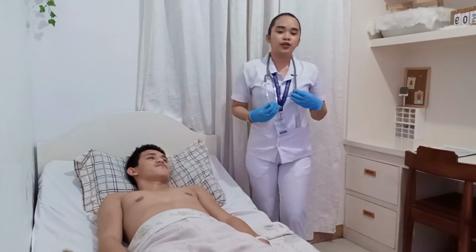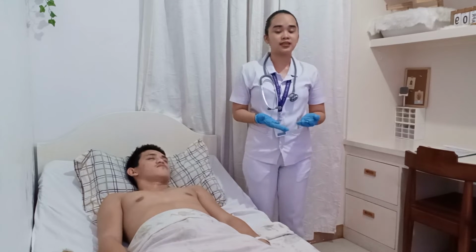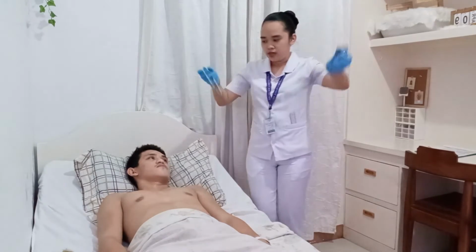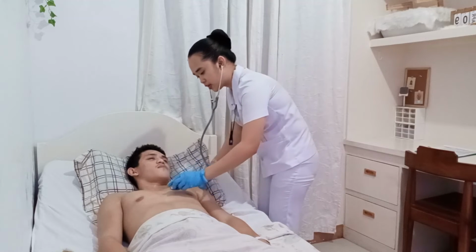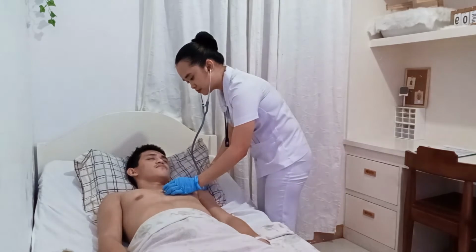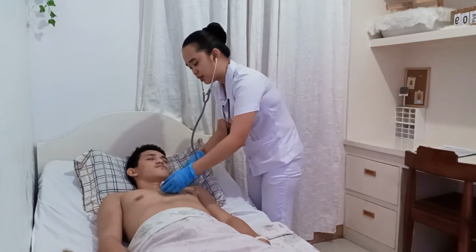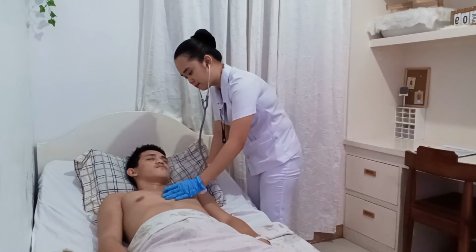Okay. So first, I am going to auscultate for the aortic area, which is located at the second intercostal space at the right sternal border. So first, I'm going to use the diaphragm of the stethoscope. Okay, Mr. Patrick, inhale and exhale. Okay, and then I'm going to use the bell of the stethoscope. Okay, Mr. Patrick, inhale and exhale again.